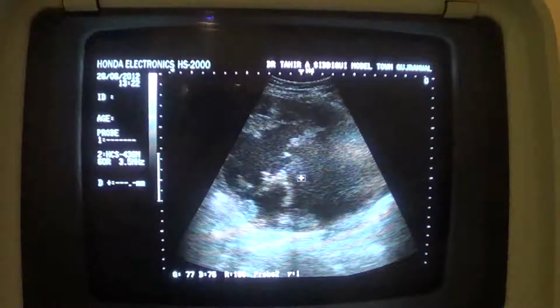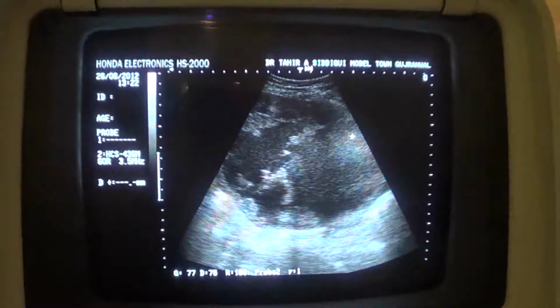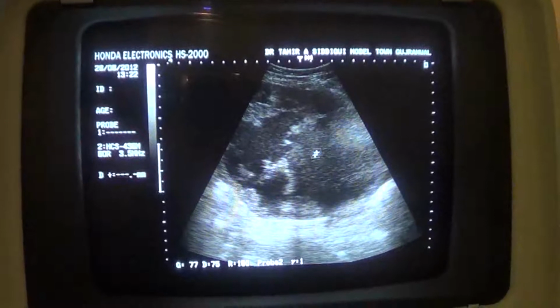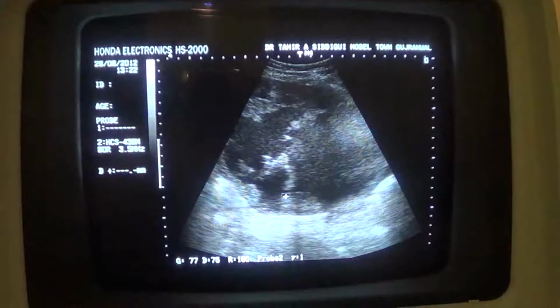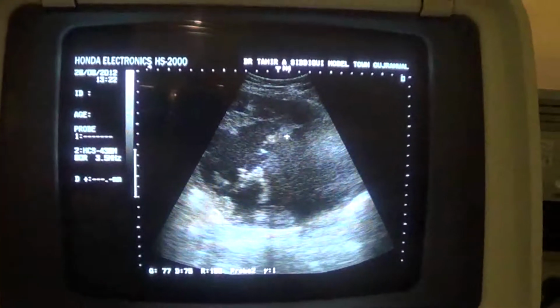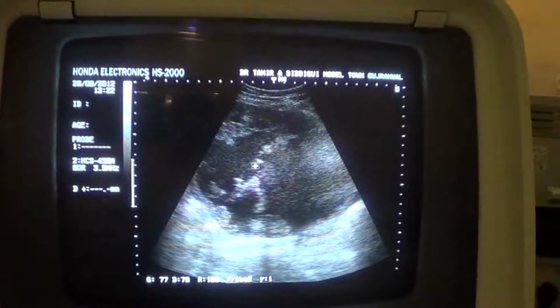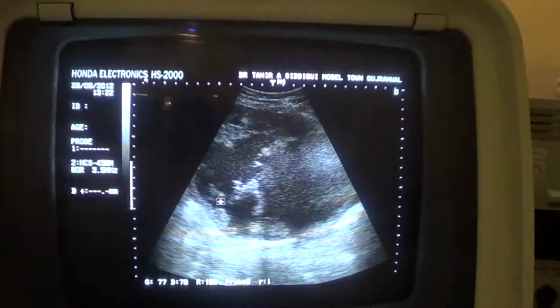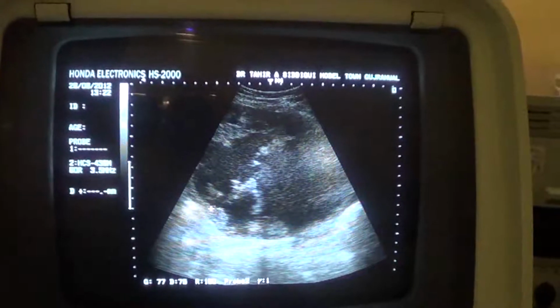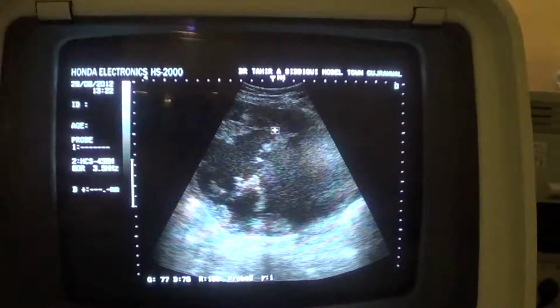Now you see this cystic area is thin walled, number one. It is full of internal echoes. These sand-like areas or particles, these are called the internal echoes. There are multiple islands of echogenic areas that do not give any posterior shadowing. This is the echogenic area, this one, this is the echogenic area. And there are dependent regions, rather with the posterior wall you see these solid echogenic areas. These are solid areas.